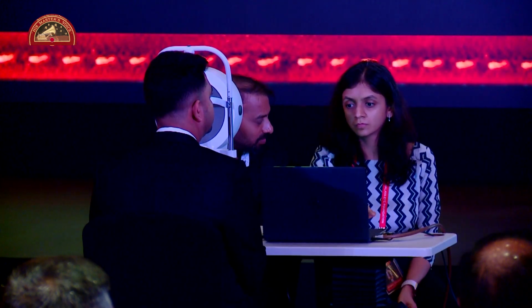Yeah, please. So interestingly, our subject seems to have undergone some laser refractive surgery. Okay, quite nice. What about the light condition when we're taking the Pentacam? That's an excellent point, a very important point which we have to stress. Are you checking mesopic conditions, or should that be highlighted?